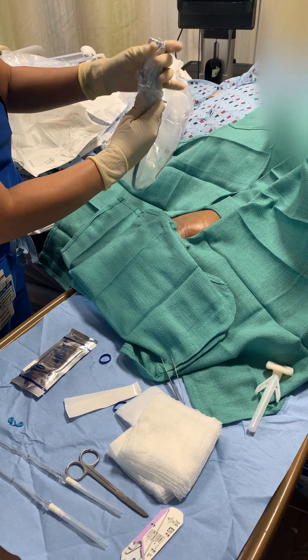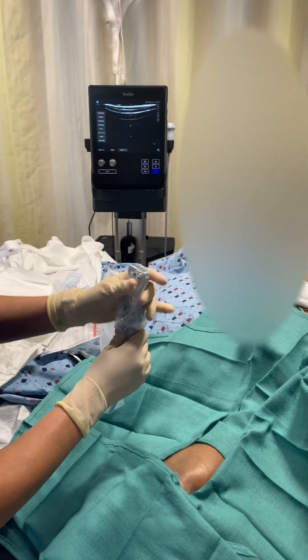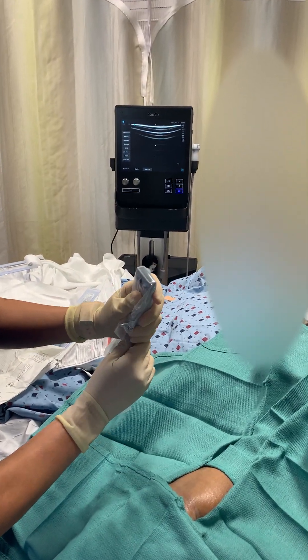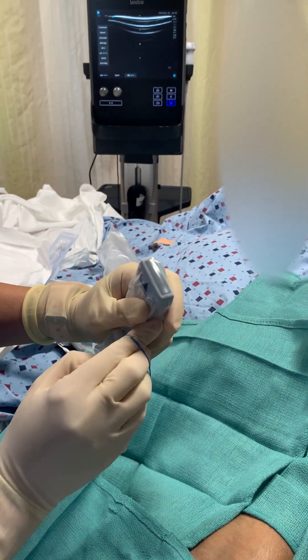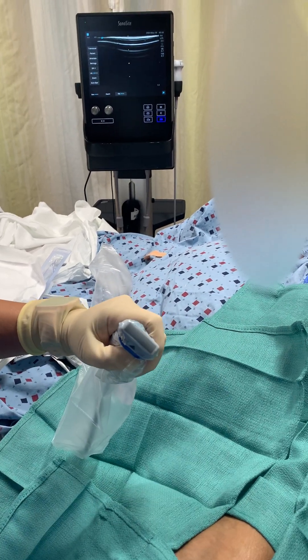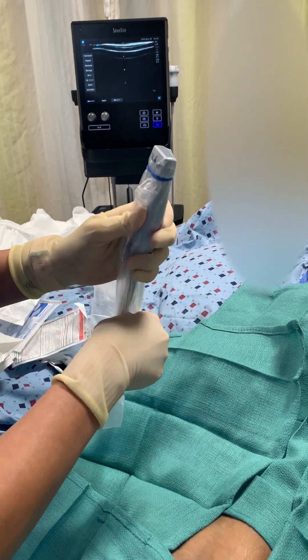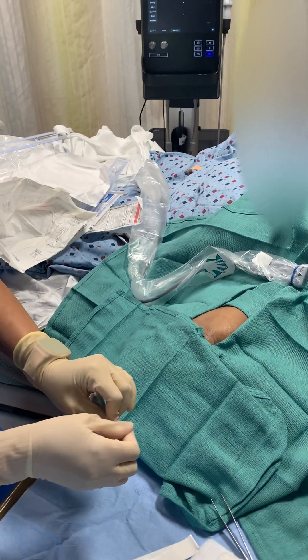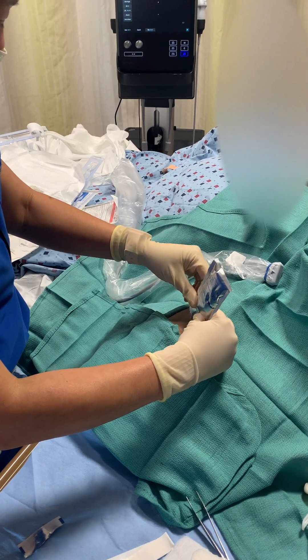You always want to make sure that you have gel or lube in the probe cover. You have rubber bands. You want it really smooth, or else you're going to have problems visualizing your vessel. We have an extra one here, just to make it straight enough. Let's check our artery first. Today we're using our radial artery.